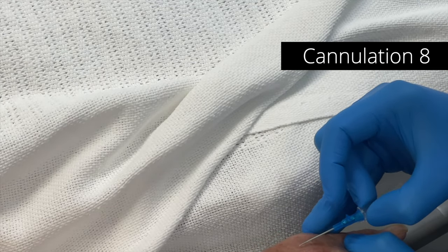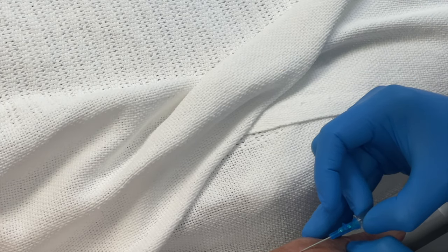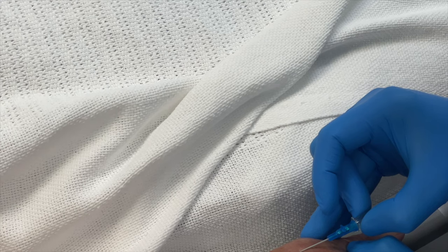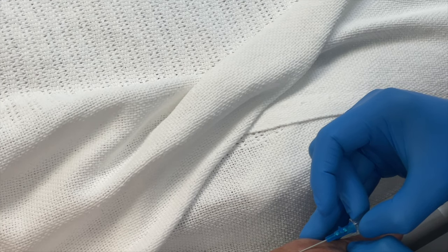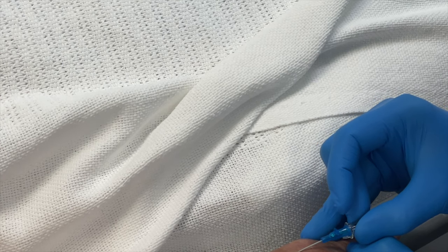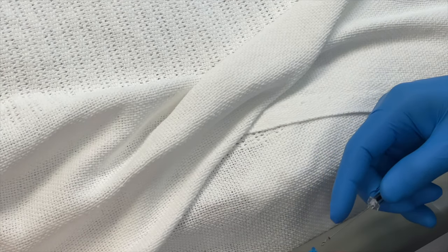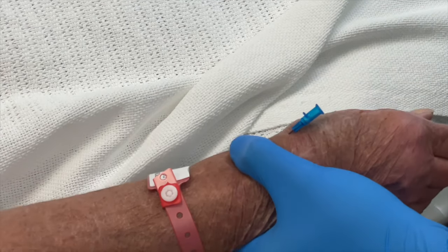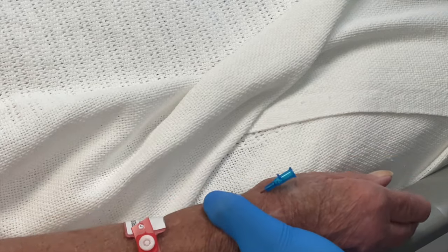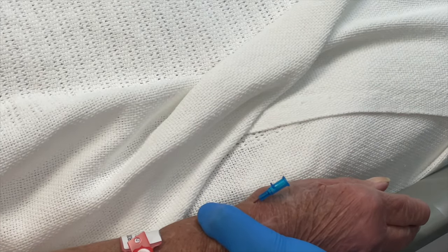Apologies for this really poor camera angle. Essentially I'm going through a cephalic vein on the inner radial side of the arm. The great example here is that my ring and little finger are anchoring the hand, making sure I don't have a tremor — it makes my whole structure really stable. This is really useful for the most difficult veins, where even the slightest tremor could cause a problem and could cause a puncture on the other side. You want everything to be really, really stable when you're doing these difficult cannulations.